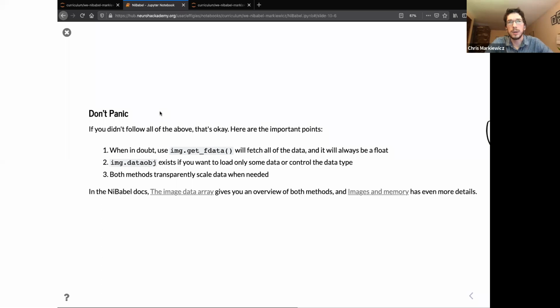But I think it's also really useful. I use it all the time. I just open up a Python terminal or a Python shell, load a file and look at it to figure out what I'm doing. Often you'll open it up, look at the file, write a little bit of code to do what you want, and then turn that into a function. Whether that becomes part of your analysis package or pre-processing, or something you want to share with others, is up to you. I think NiBabel gives a good interface for both modes of operation. So hopefully that answers your question.